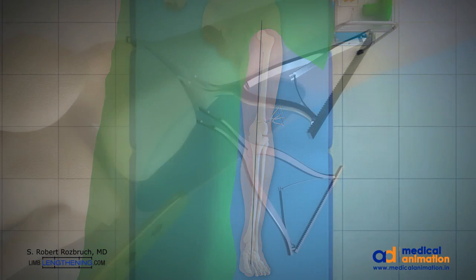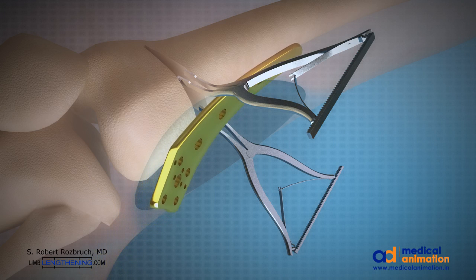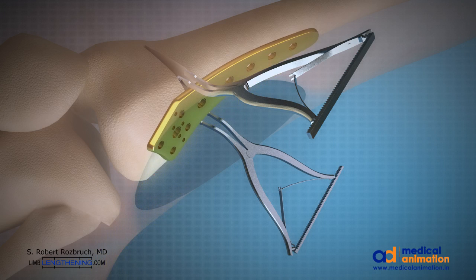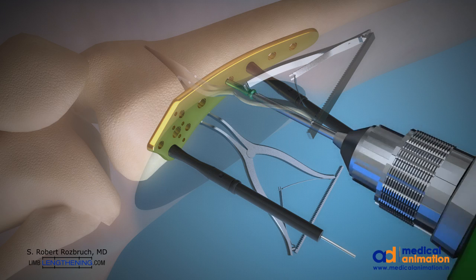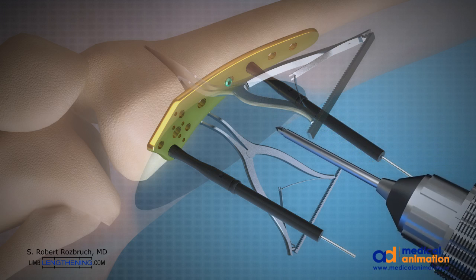The titanium plate is then inserted into the optimal location to stabilize the osteotomy and provisionally fixated. Stabilization with locked titanium screws into the plate is performed. I typically use four bicortical screws in the proximal segment and five locked screws in the distal segment. This provides excellent stability.